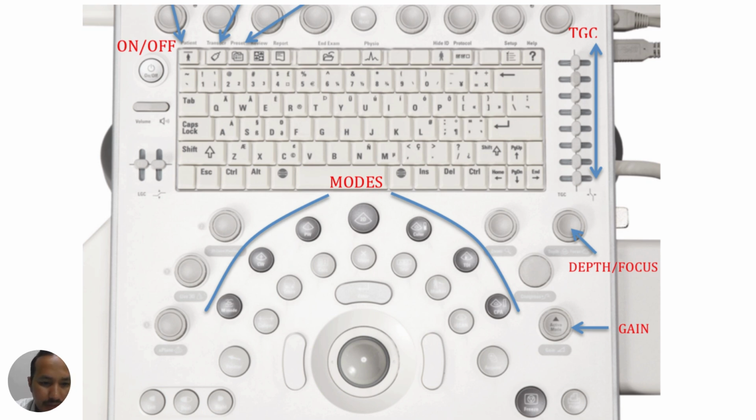All of these functions are important to adjust and maintain the quality of the image, so the doctor can see the ultrasound image clearly.